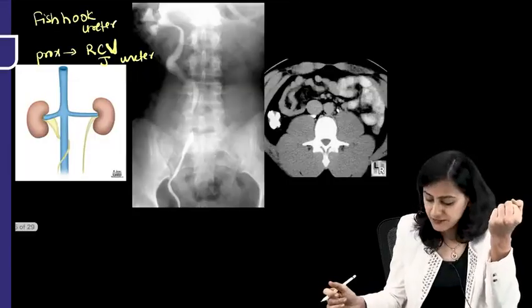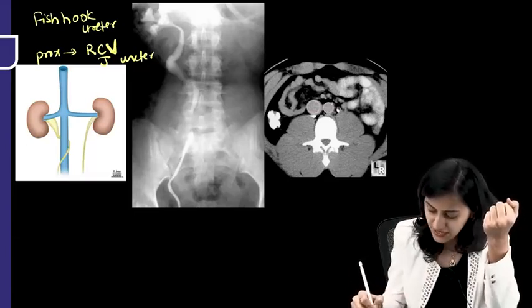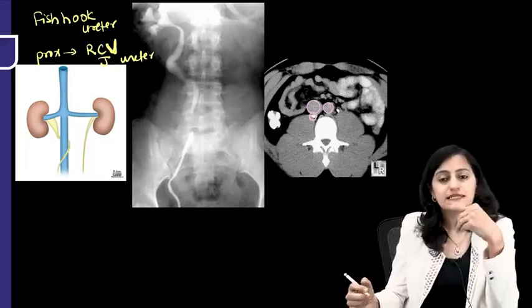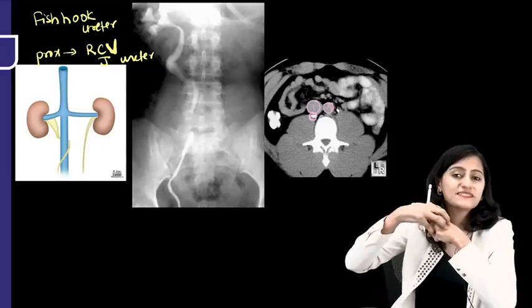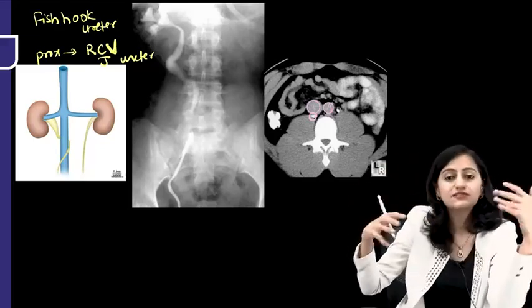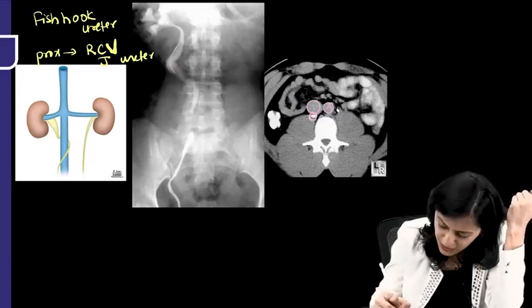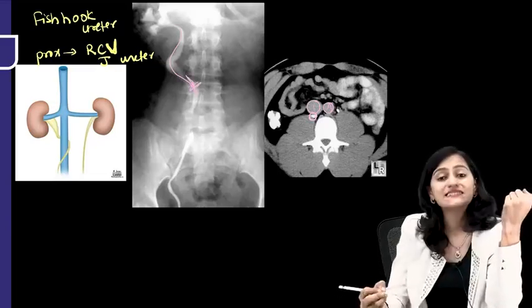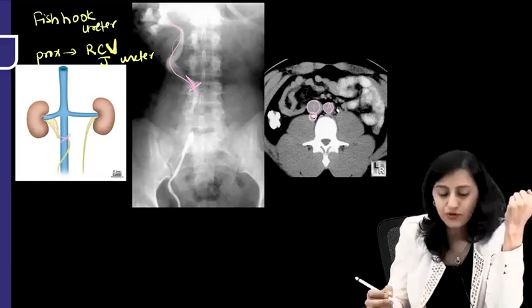Next, what we have here is this retrocaval ureter. So this is the IVC, this is the aorta, and behind the IVC you see this contrast-containing ureter. So embryologically it is a defect, the ureter is retrocaval. So the IVC compresses the ureter. So the proximal part of the ureter and the kidney is dilated. So proximal hydronephrosis, hydroureter is what we have. So look at the ureter here, which is overlapping the vertebra, telling that it is retrocaval. So the retrocaval ureter shows this proximal hydroureter.